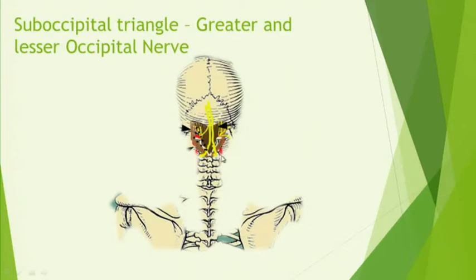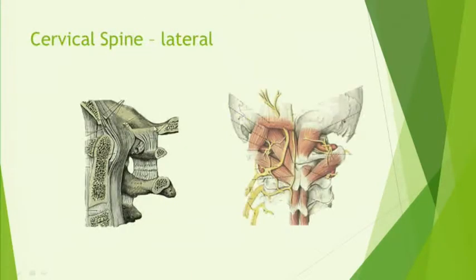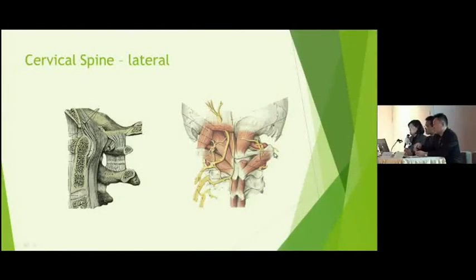As you see in the anatomy diagram, the greater occipital nerve comes out at the level of C2, goes in the posterior direction, and then goes cephalic. So with ultrasound, we would like to identify first by scanning from above the occiput, and then scan down, and then we can see the most prominent level of C2.